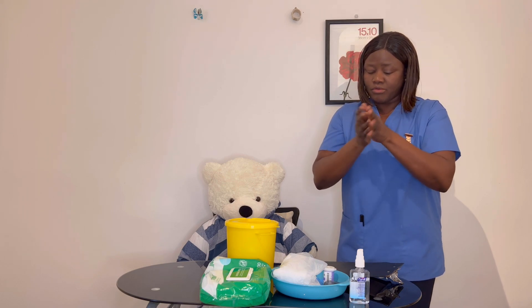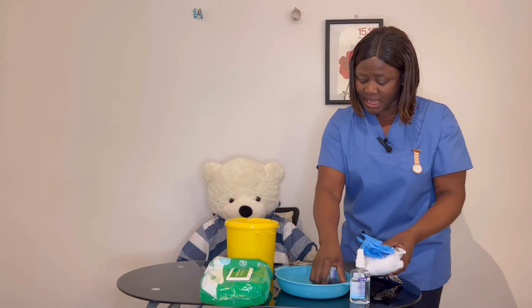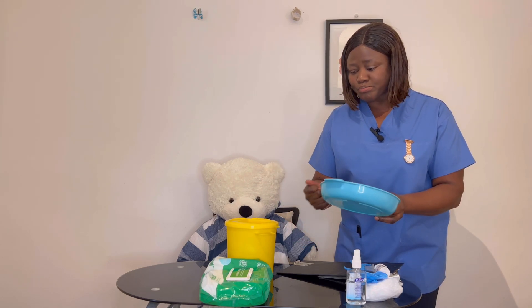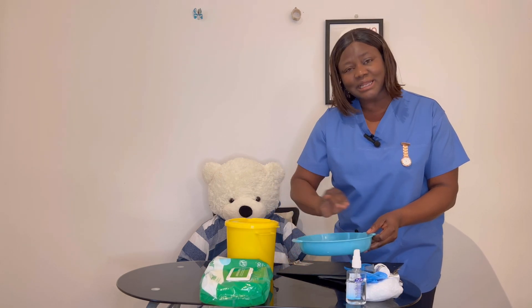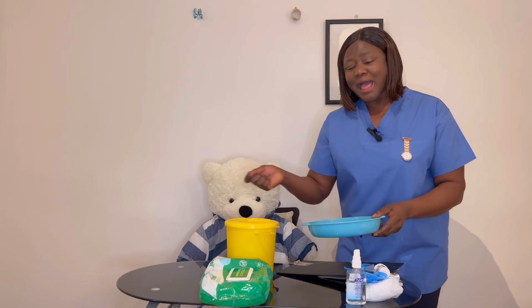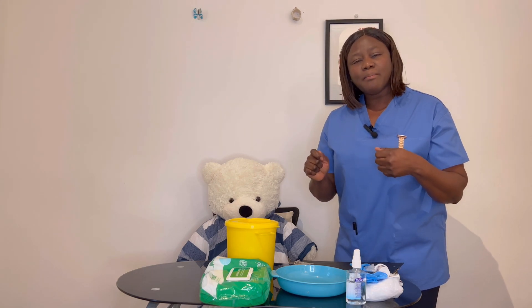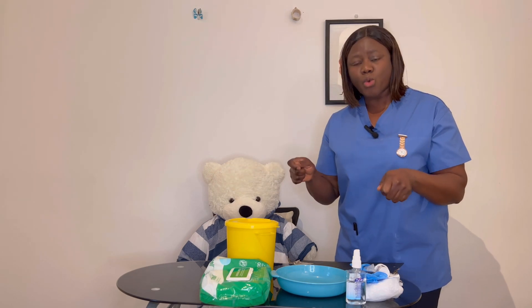I'll do my hand hygiene. Getting to prepare my instruments, I've confirmed with my assessor that my tray has been cleaned within 24 hours — it is a reusable tray. I'll do my hand hygiene, put my glove on, and use cleaning wipes — confirmed in date, not expired. I clean in a zigzag manner and discard in the clinical waste, then clean the backside in a zigzag manner and discard. The glove used to clean the tray is discarded in clinical waste, and the apron as well if not continuing to use it.